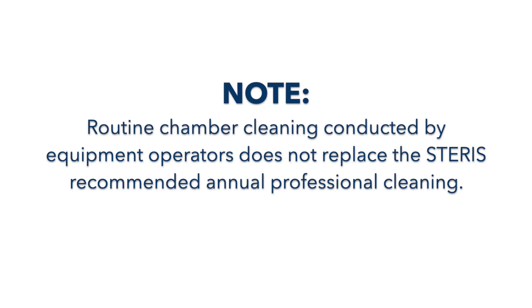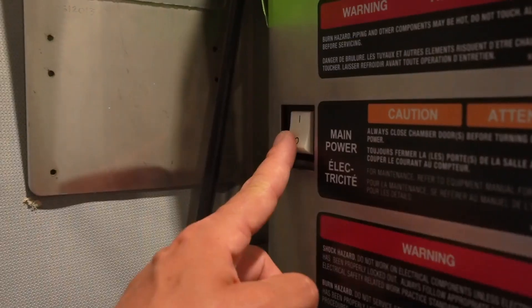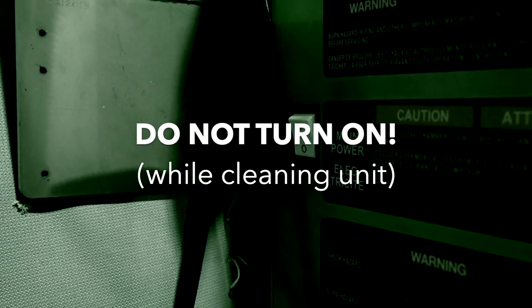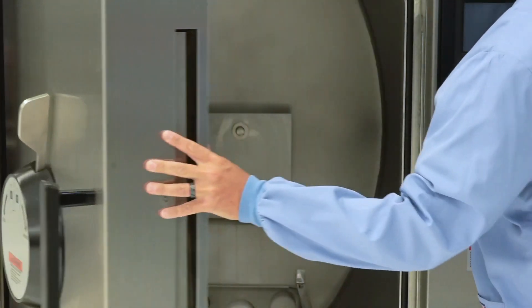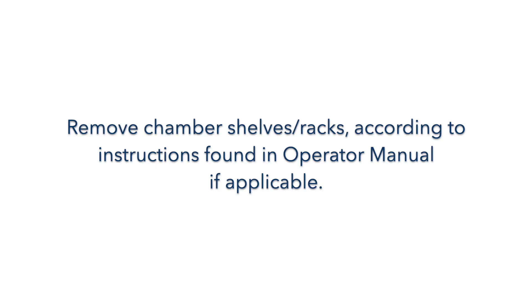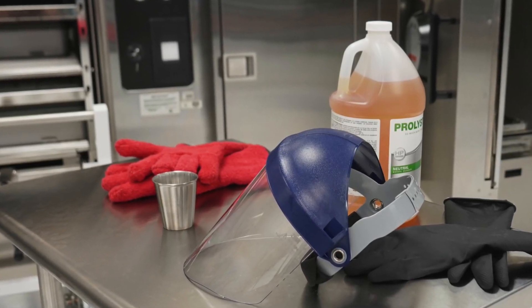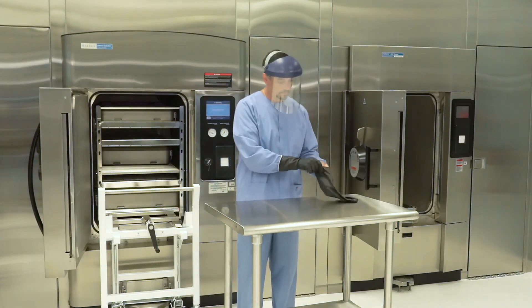Routine chamber cleaning conducted by equipment operators does not replace the STERIS recommended annual professional cleaning. Chamber Cleaning Procedure, Step 1: Make sure to follow facility policy and STERIS operator manual procedures to turn off sterilizer power and to not turn on the sterilizer while the equipment is being cleaned. Step 2: Open the sterilizer door and allow the sterilizer to cool approximately 4 to 5 hours. Step 3: Remove the chamber rack and shelves according to instructions found in the operator manual, if applicable. Step 4: Put on heavy rubber gloves, a protective gown, and a face shield or safety goggles. Follow your facility safety procedure at all times.